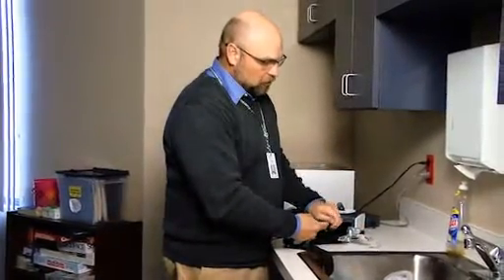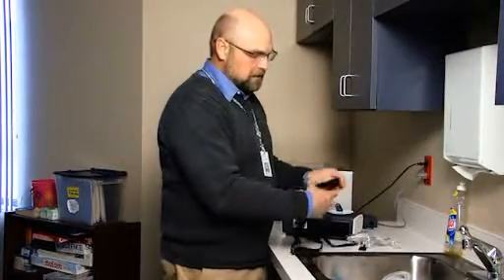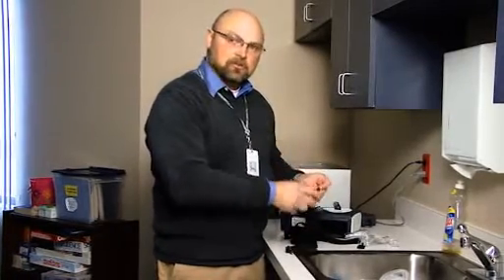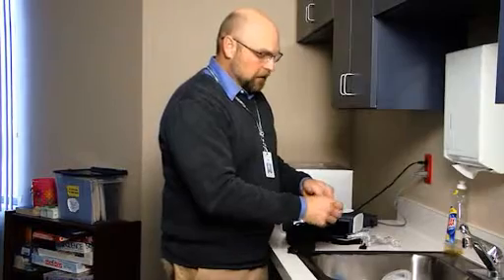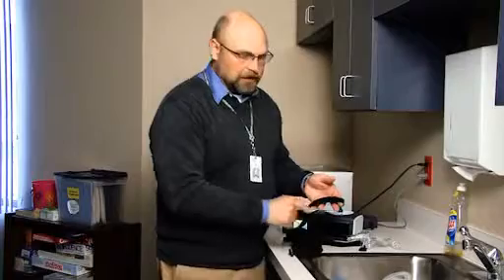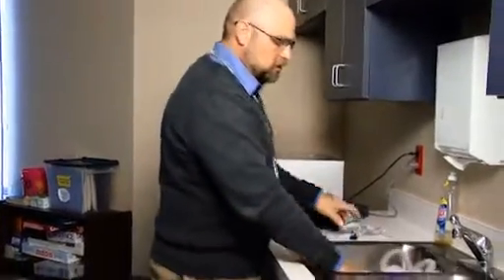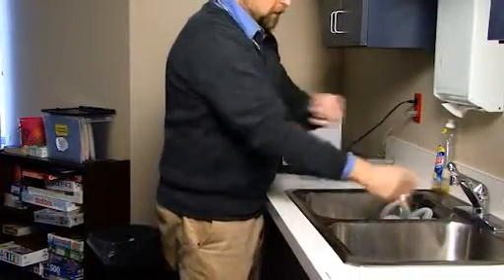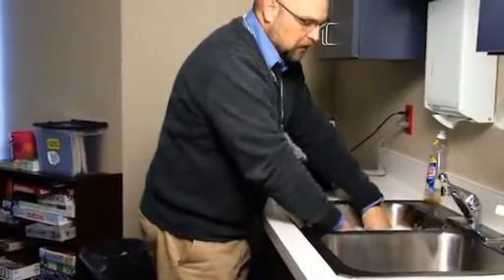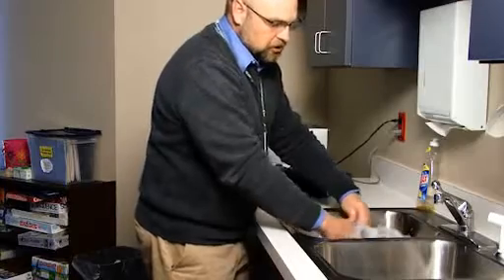The headgear I do still separate, and it's just a Velcro, pulling the Velcro. One of the things that you might want to do, and a lot of people end up doing, is somehow marking where it fits to your size, so you don't have to readjust that all the time. You could do some whiteout, or on the white ones they put a Sharpie or something, just to mark it. But all of this you want to submerge and just put it in the sink and slosh it out, rinse it out. Make sure you get soap in it, and wash it just like you're washing dishes.